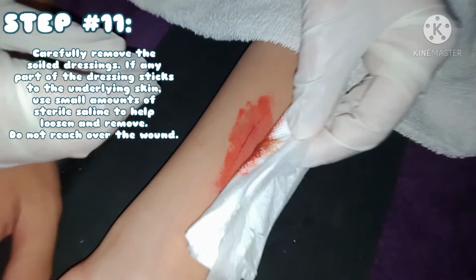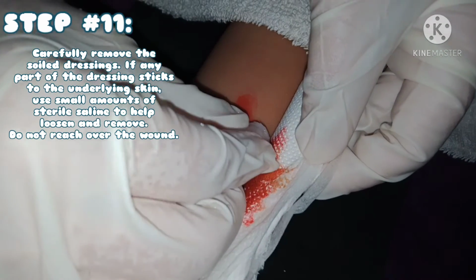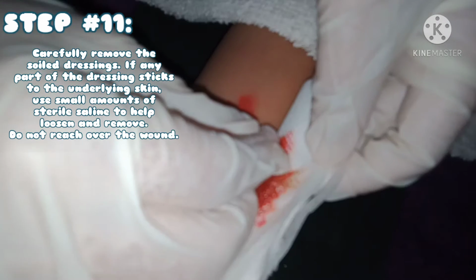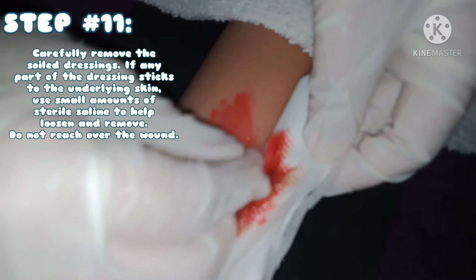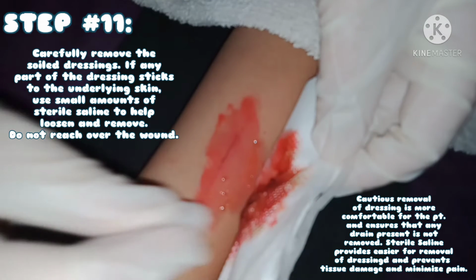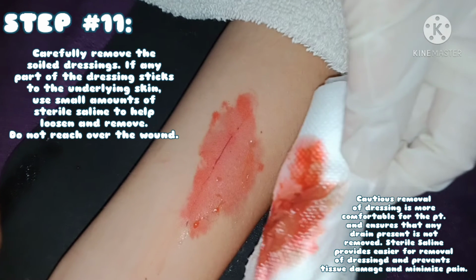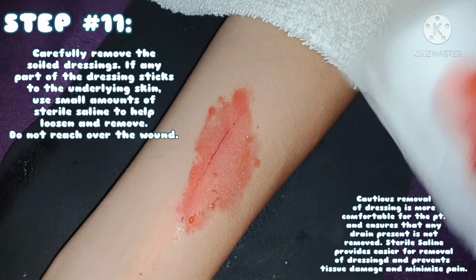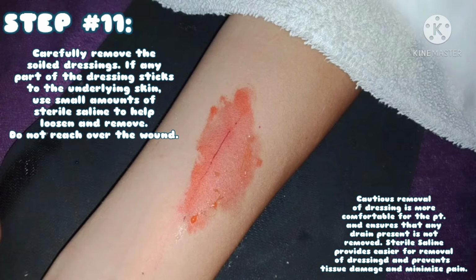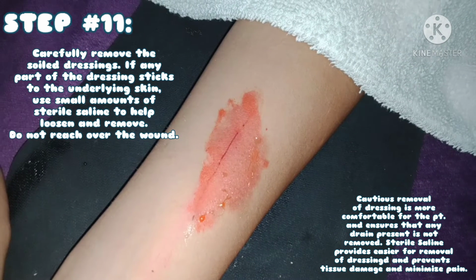Step number 11. Carefully remove the soiled dressings. If any part of the dressing sticks to the underlying skin, use small amounts of sterile saline to help loosen or remove. Do not reach over the wound. Cautious removal of dressing is more comfortable for the patient and ensures that any drain present is not removed. Sterile saline provides for easier removal of the dressing, prevents tissue damage, and minimizes pain.